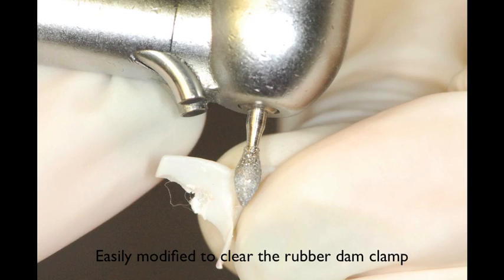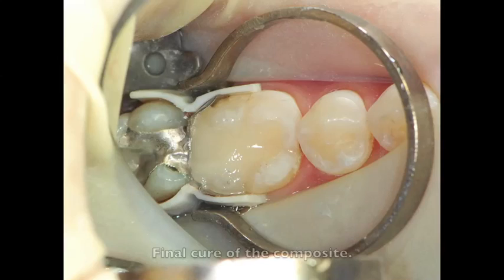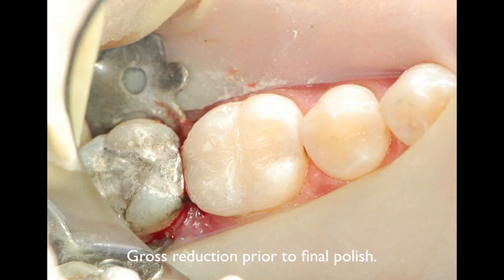I'll modify the wedges with a diamond, football-shaped diamond burr to clear the rubber dam clamp, and then place the wedges on the buccal and lingual, sealing off the gingival floor. The tooth is then incrementally filled with the composite of your choice. A bulk reduction is done with the diamond burr, separating ring removed, and the matrix band teased out with a really strong plier or hemostat and needle holder.